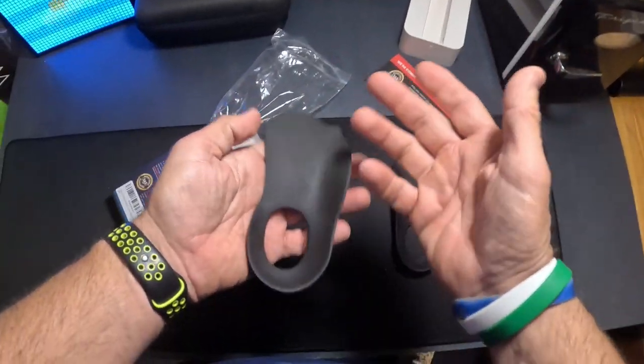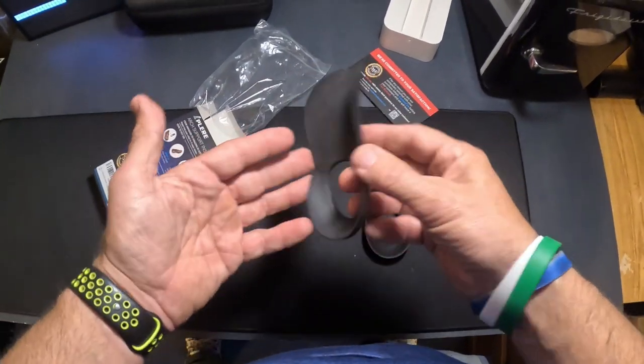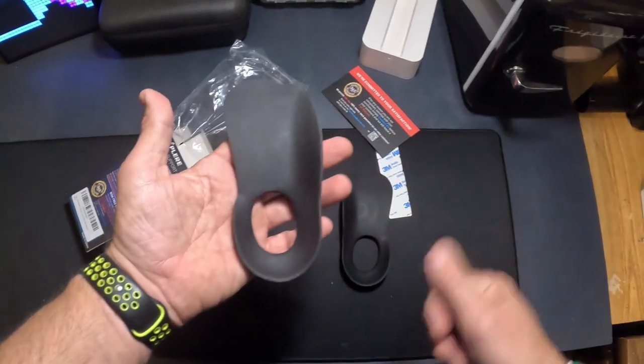I've got a pair of hiking shoes that don't have a lot of support in them, and I'm going to be doing a lot of hiking coming up. So I want to add these to them and just make them a little more comfortable. Let me grab those now.